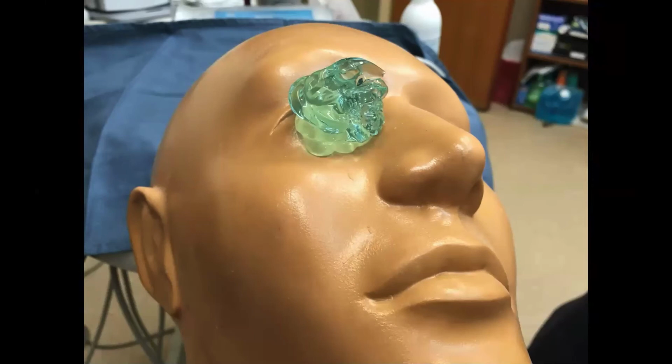Now, a normal intact globe won't be a problem if you put a little bit of pressure on, but it may not be comfortable. But if you're scanning someone who has a concern for a potential open globe, if they're a trauma patient and you don't know if their globe's open or not, then you definitely don't want to put extra pressure on. You really want to avoid that by making sure there's a big, nice, thick standoff pad that you can glide things over.